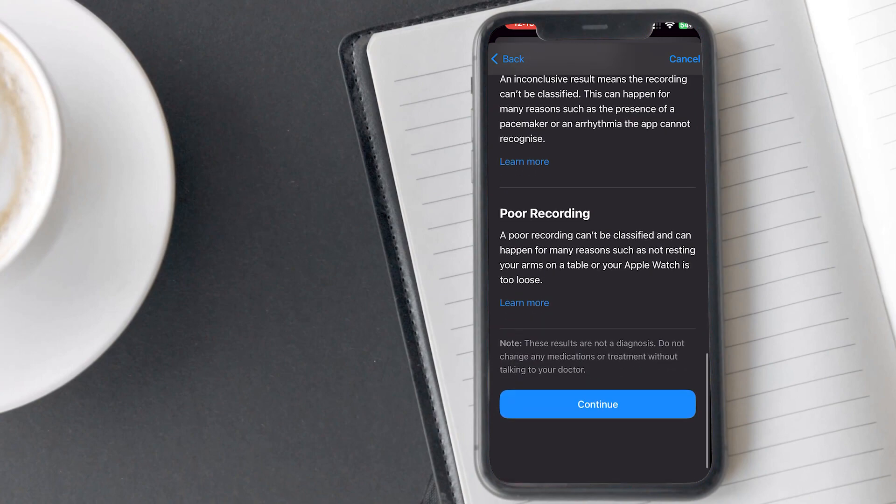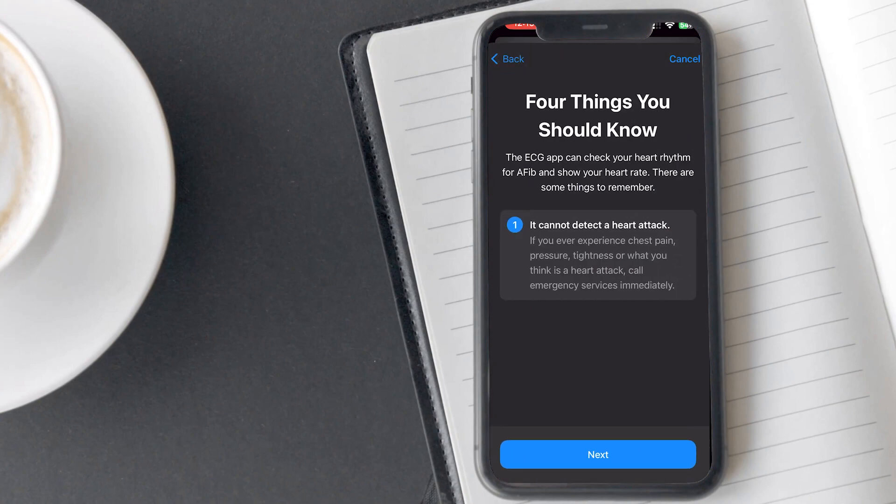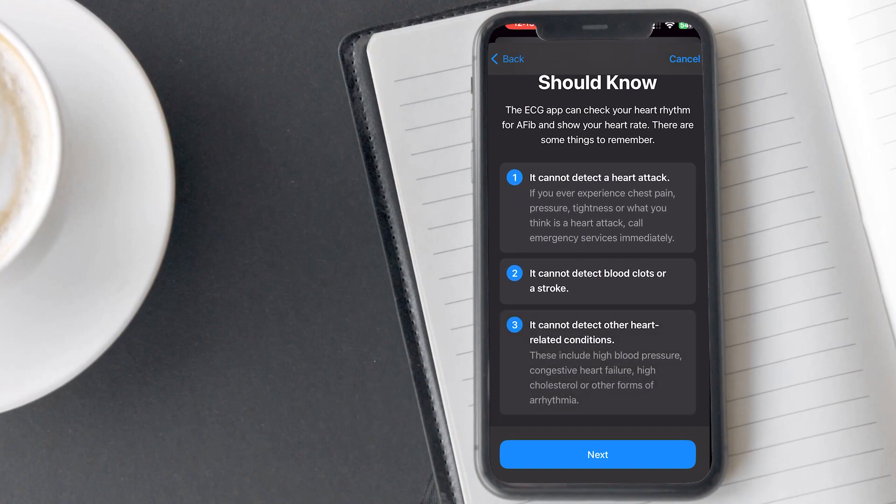Tap on continue. On this next screen, Apple will show you four important points you should know. First, it cannot record heart attacks. Second, it cannot detect blood clots or stroke. Third, it cannot record any other heart condition. Lastly, if you are not feeling well, then connect with your doctor immediately.